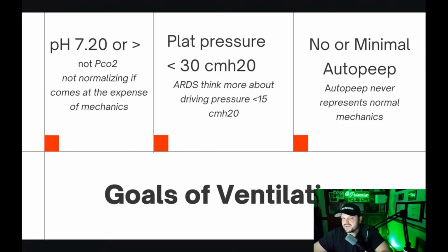But when I set the ventilator, and I'll bring this up later in an example, I go for above 7.2 certainly to start, and then if I can influence the circuit, if I can influence the ventilation more to get as close to normal as possible, I'll do that. But I don't shoot for like 7.45. That's not how I do things.